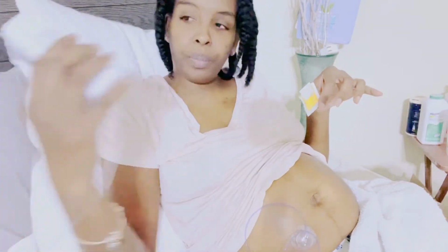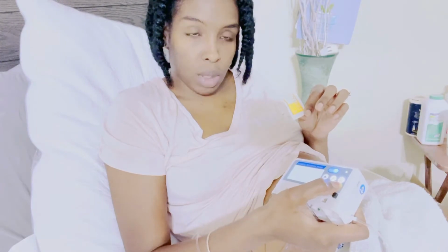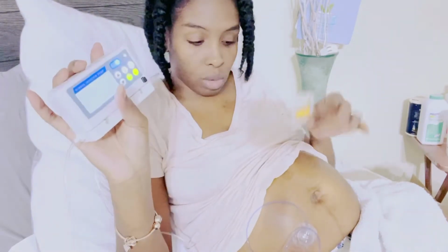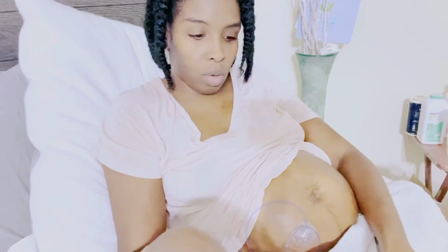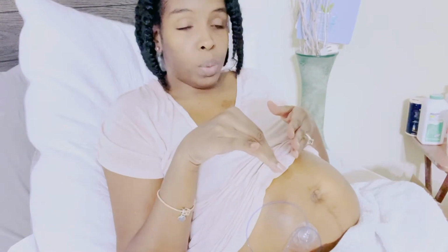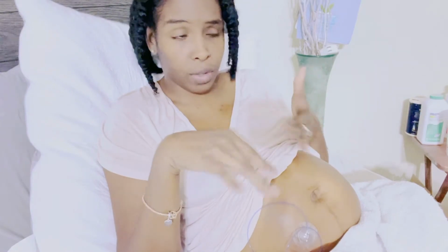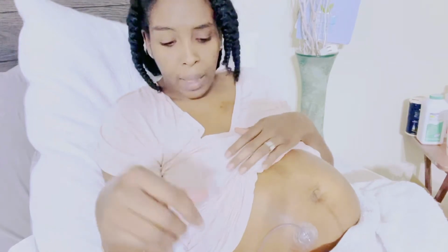First we're going to pause this machine, because we don't want medication running out when we take this loose. I have a clean towel here that I'm going to put everything on top of. You're supposed to have a needle box to put your needles in, and I guess you could put your biohazard stuff in there as well, like your tubing, if you want. But my little case is very small. It's over there actually, I'm not going to get it.